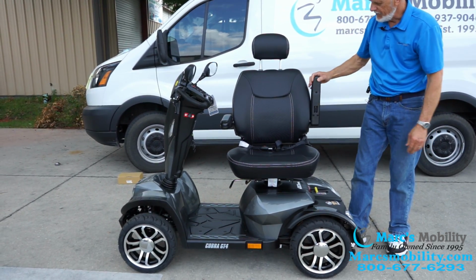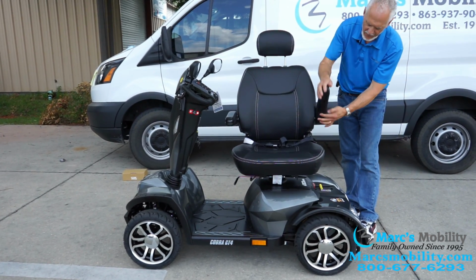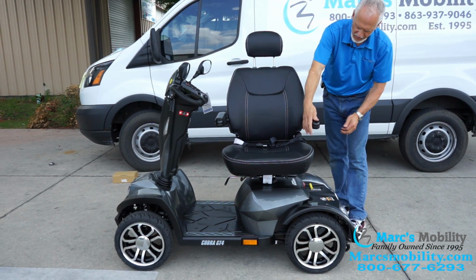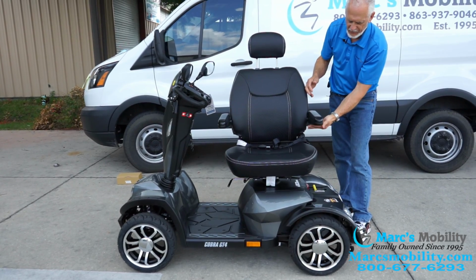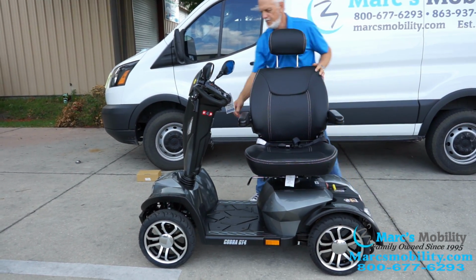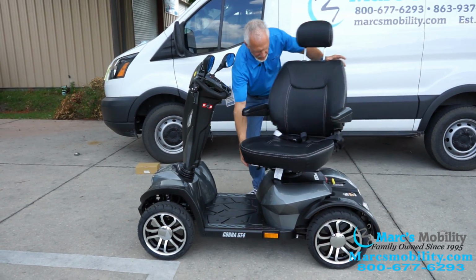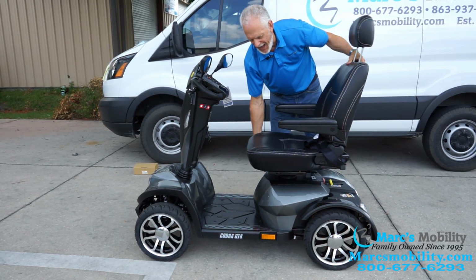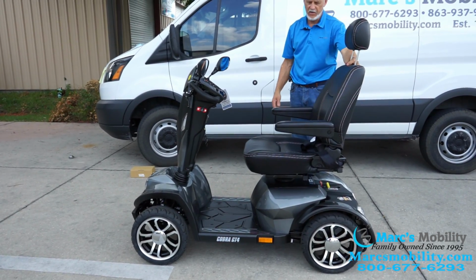The arms raise up, and the arms are adjustable with this knob under here. If I turn the knob, I can adjust the tilt of the arm. You can see when I'm turning it, it's going up. You have an adjustable headrest. You do have a swivel seat, like I mentioned, and this seat will also slide forward and back. This is as far back as it'll go.